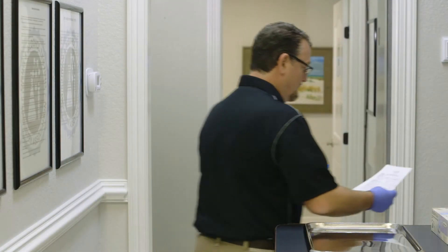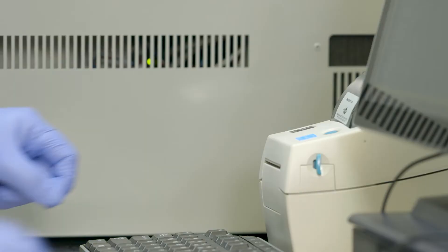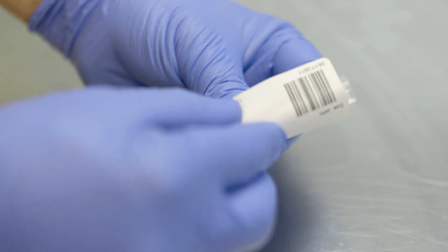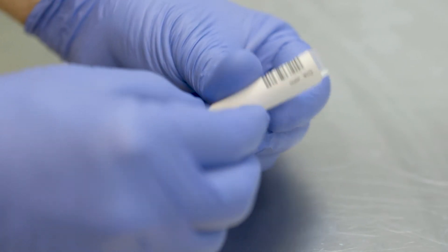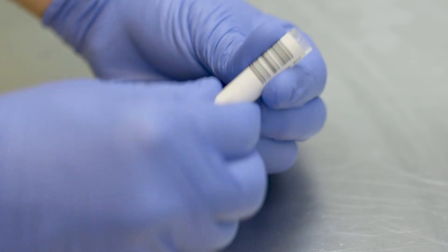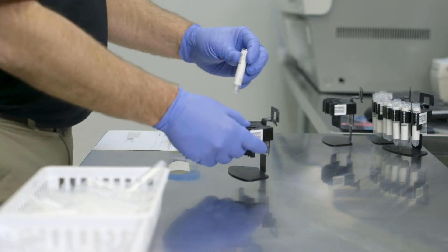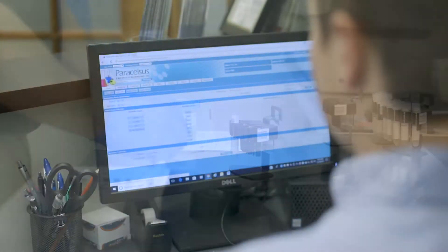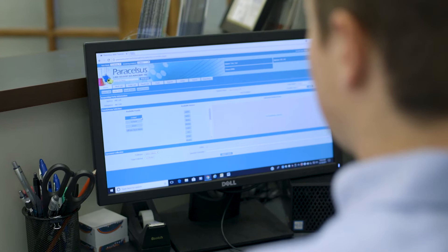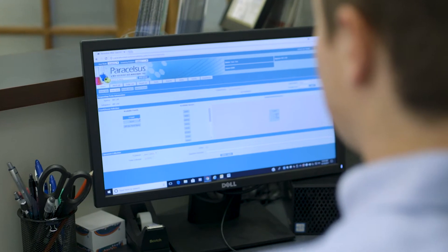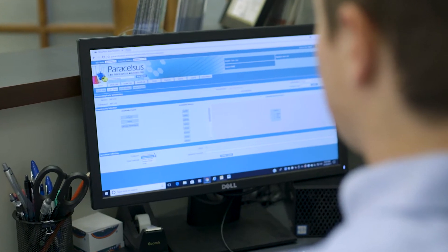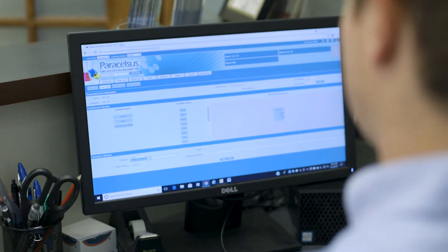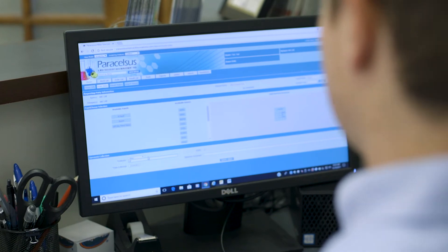Once the information is verified and tests confirmed, the lab tech prints the barcode for the test tube that goes into the analyzer. With the Paracelsus software, you can select a randomized testing panel to vary the drugs tested on each visit.